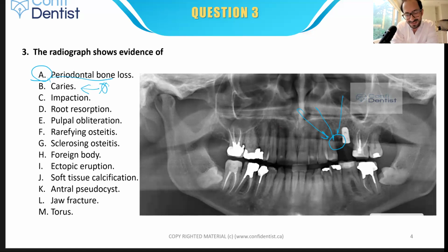I think it's just too risky to select caries based on pan. Because of the quality of the X-ray, pan is not the best X-ray for caries selection. I only choose caries when I'm 100% confident. There is a good chance I have caries here, and there might be something going on here, but again, too risky. I myself don't select caries, but if you select it, that's a neutral option. So anyone who selected the option, that's neutral.